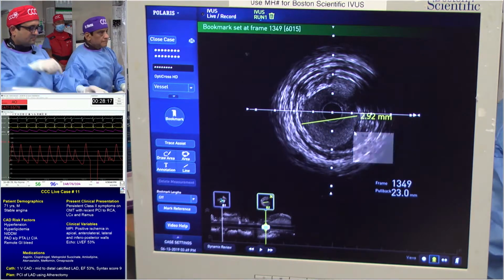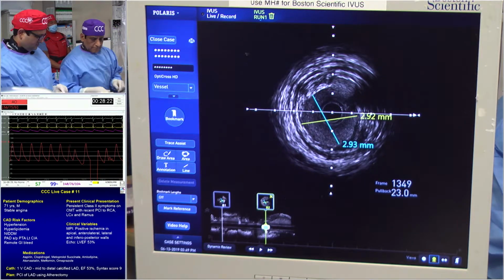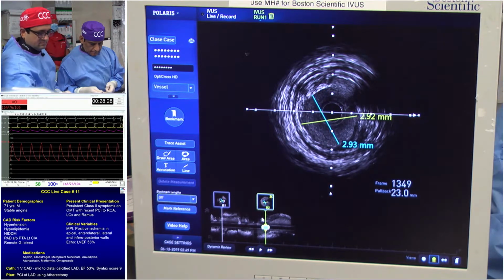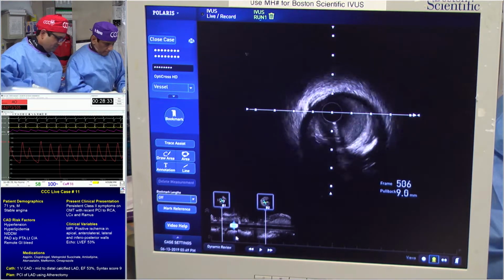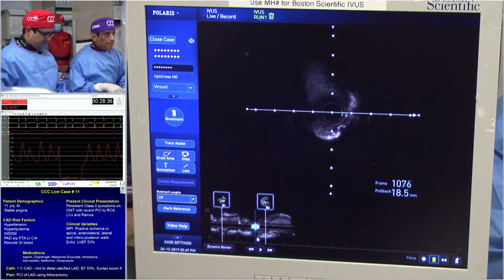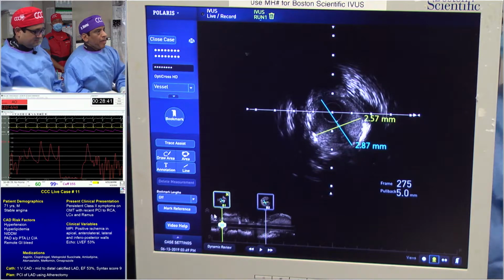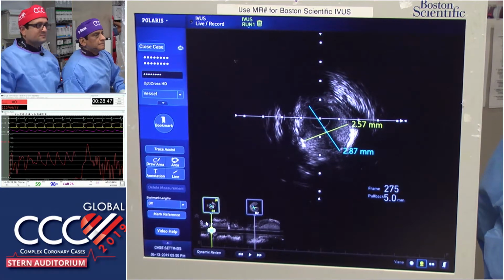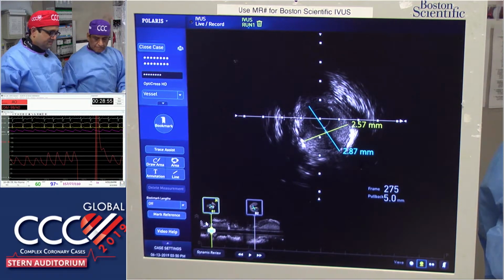Yeah, it's not exactly the same. You remember that? So, you know, it's a lot to learn. I think the survivors of this type of disease are naturally selective. You know, the nature selects who survives. So you believe in Darwinism here? The ones where the lipid core embolized. Yeah, it's like a Darwin thing. The ones that are not embolized, they thrombose, and in the left main, forget about it. He wouldn't make it to the hospital, yeah. So this is like when you see aneurysms in the proximal vessel and you don't know, should you seal them, not seal them, will they distal embolize? It's hard to tell. Like a Kawasaki. It's much easier to stent them, and then you sleep in peace.